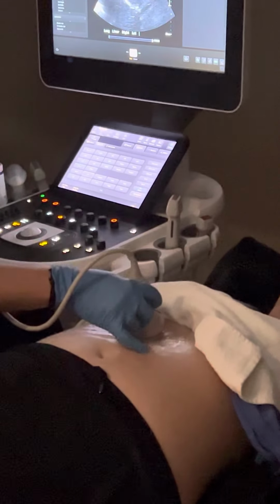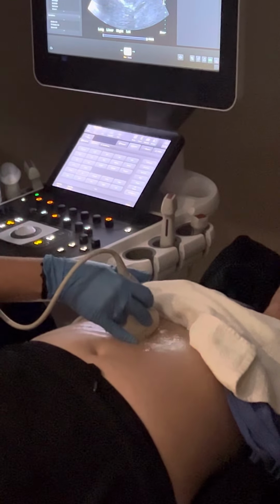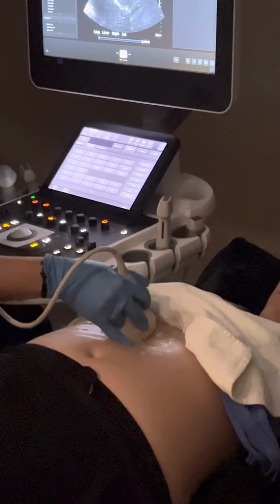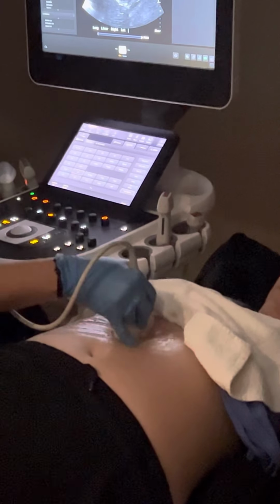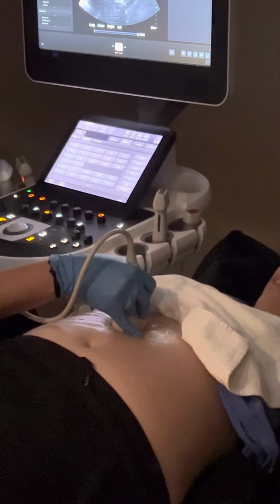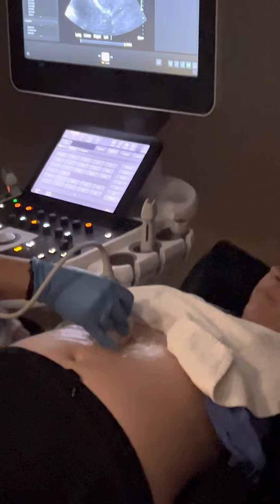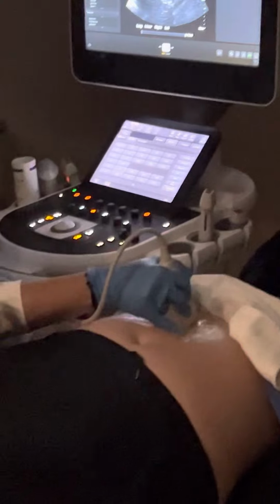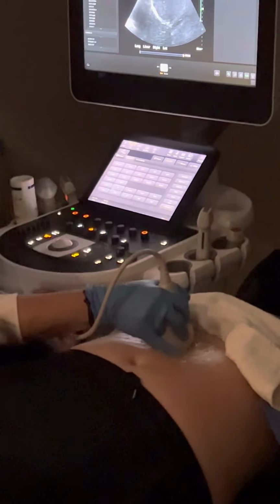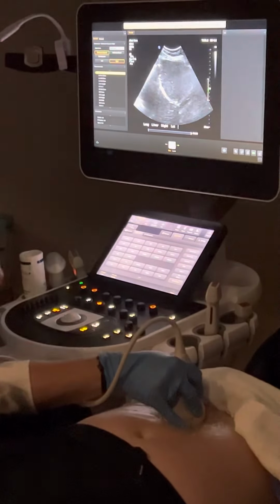You have to practice getting all of the images for the right lobe in both subcostal and intercostal planes. But for your test, where you can see it the best. Okay? So, just wanted, that's right. For the liver test, you have to do both. Oh, you do have to do both. But for the abdomen test, the abdomen one. So yeah, sorry, I don't mean to confuse. Scratch that. We'll write a copy over that in your recordings. For your abdomen complete, you just get it where you see it the best. For your liver test, just for the liver, you still have to get intercostal, subcostal. Okay. Lateral.